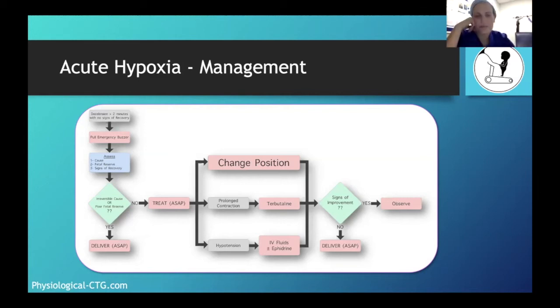But at this point, what you want is the heart rate to be up, with a good variability, not with a flat variability. The problem is sometimes people see that the variability is completely gone. They give a terbutaline, and then they watch, okay, terbutaline has just stimulated the heart to become a bit more tachycardic. So the heart rate that was 60 is now 80, but the variability is completely flat.